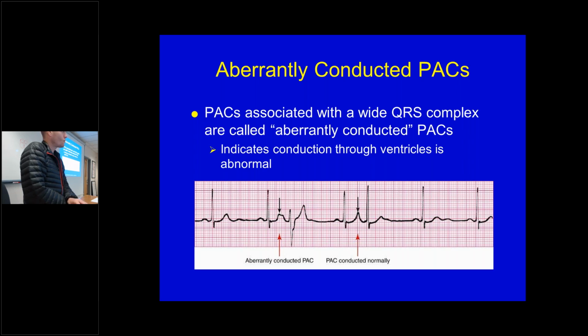Then does that also have like AFib in there as well? Because looking through it, you can see the QRS complex for the first one, the T, and then there's a little bump there. Would that be a P wave and then another P wave for the next complex? Say what, on that one? If you look at the first complex, and then just after the T wave, it kind of goes up to another bump there. What's that bump after the T wave? It's a U wave. So it cannot be AFib because why? You have P waves. You don't see P waves in AFib. Why? Because it's just a stunned atria, right? There's no really full contraction. It's just fibrillating. So you just get this kind of undulating baseline.